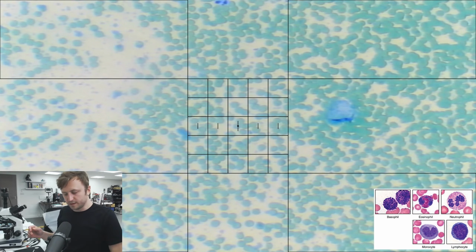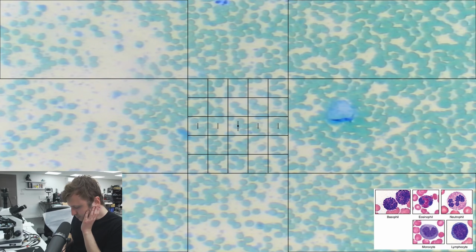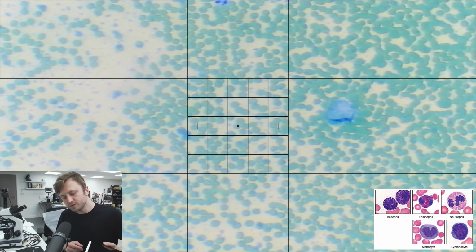So let's see if that adds up to 100. I don't trust my basic counting skills, so I am using a calculator. Yes, that does. So, according to my first ever actual differential leukocyte count on my own blood, which may be completely inaccurate, I am 38% neutrophil, 36% lymphocyte, 3% monocyte, and 23% unknown. And of course, that unknown could be divided up into any of the others. Now remember, this is a differential, not a volume measurement, so it's not telling us anything about how many there are per liter. It's entirely comparative between the types.